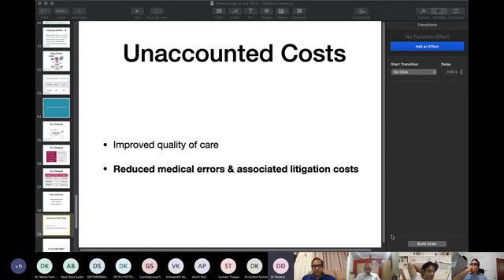Only thing, we will tell our nurses to put on the SpO2 and so on. I think Suresh told he is going to bring some Suntech people. Suntech has NIBP. Suresh should take her in the line, then she will guide us. In Suntech NIBP, we have to pay 30,000 extra only for neonatal, pediatric or adult BP. Their system is not the usual oscillatory method that all the machines use to give BP, but it is more accurate.